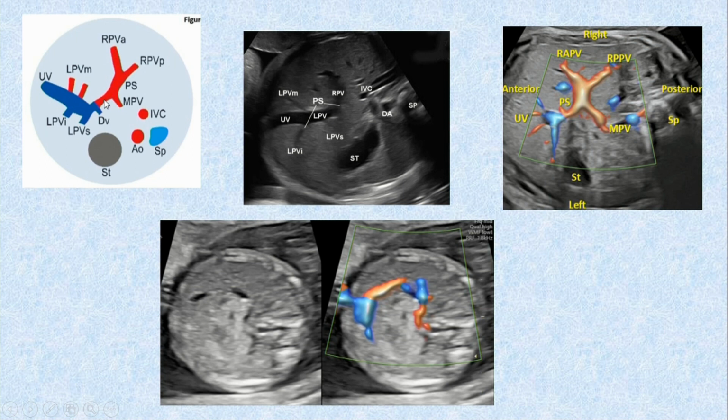So we need to be perfect with this anatomy, because abnormalities of these are very important pointers, because if the portal system is not developed, then these fetuses will die in the first few days of life. You have to be very particular about this. Visualization of this X in the last trimester becomes very important. So this is the anatomy.